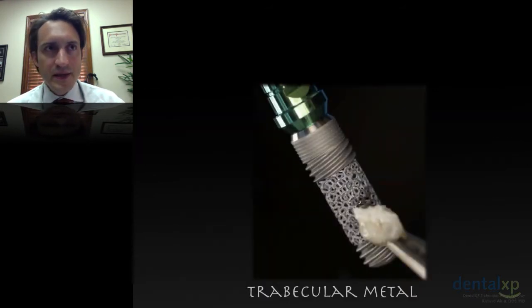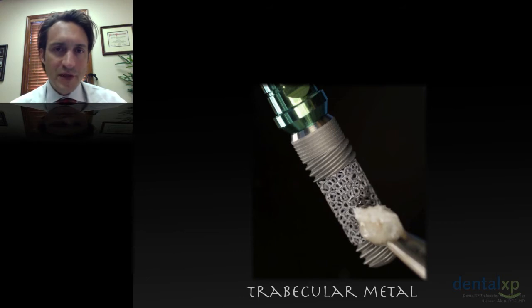Now let's go back to the case, and here's the implant. In my specific case, I feel strongly about the use of biologic modifiers. So I will use biologic modifiers with this implant into the trabecular surface. In this case, I'm using PRGF, and I've used PRGF in my practice for over 6 months. Before that, I was using PRP, but this has allowed me to use biologic modifiers in a wider variety of patients, and I love the results with it.